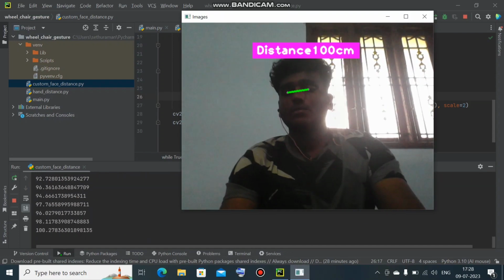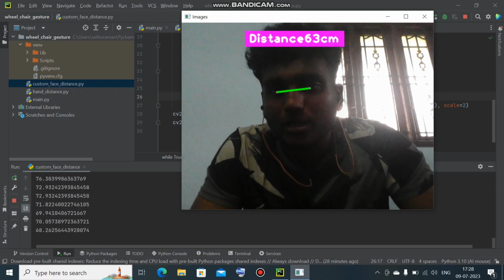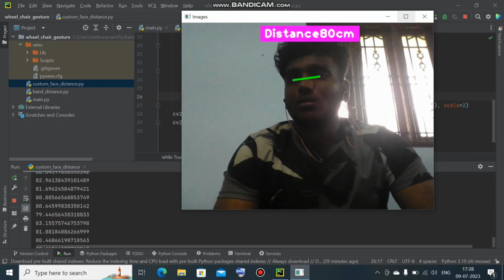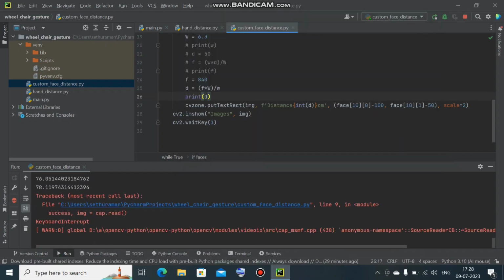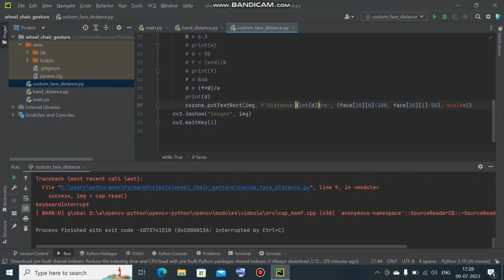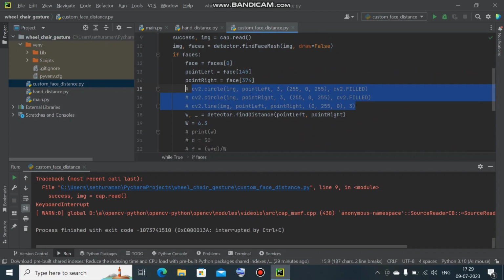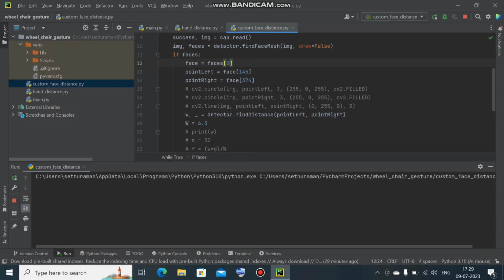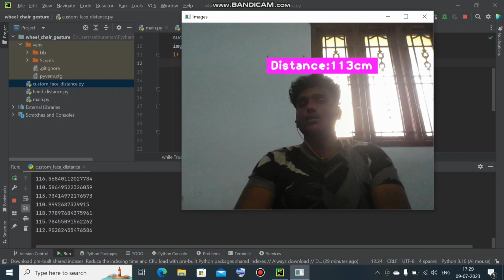Yes, you can see the distance there. The distance is 121. When I come closer, it is around 60 like that. The green line at the pink point, if you don't need to draw that point, you can simply comment this out, and let us check now. It will look somewhat clean and neat. Yes, you can see now it is somewhat better.